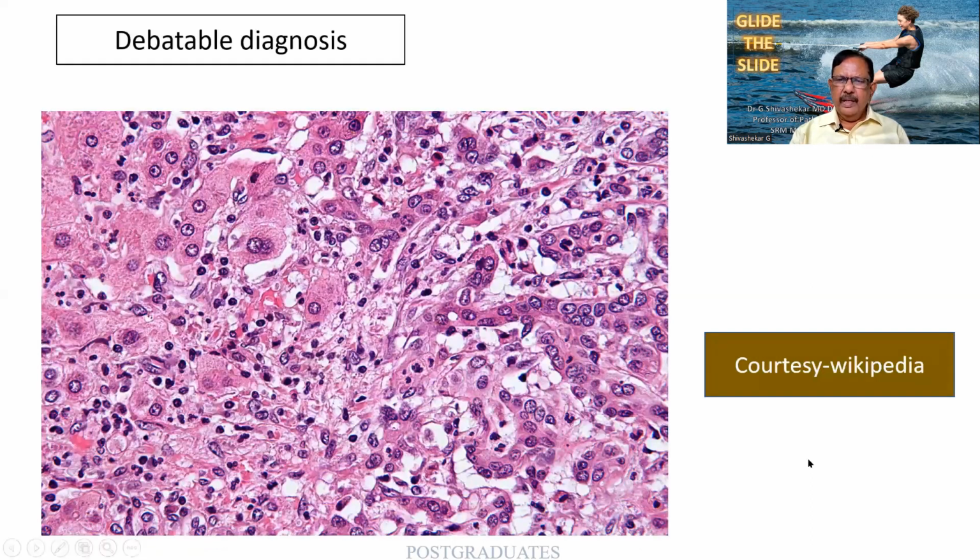This is again a fantastic picture. A slide like this, if it is given for us, it becomes debatable. And even we had some diagnostic problems because it was a biopsy, and on this side, I am finding polygonal cells, which are large with oxyphilic, eosinophilic cytoplasm, the hepatocyte. And on the right side, I am finding the glandular configuration of the tumor cells, which have been described earlier. So this is the case of a cholangiocarcinoma.